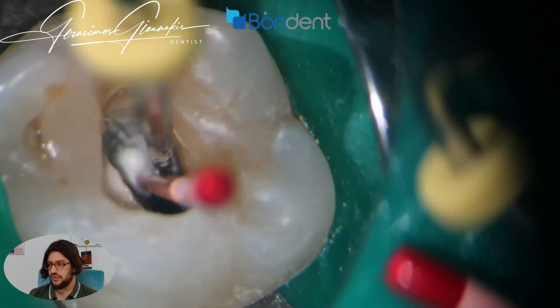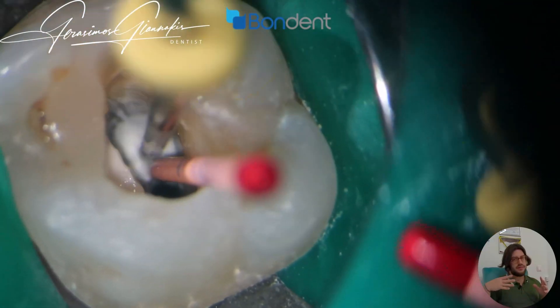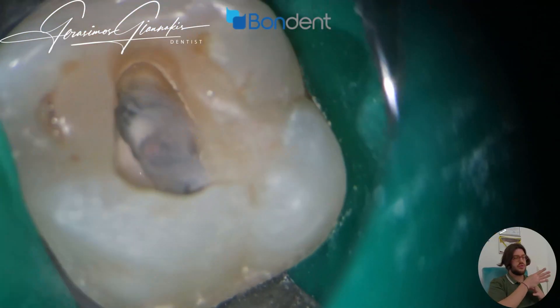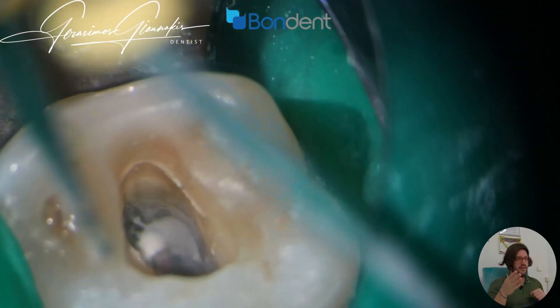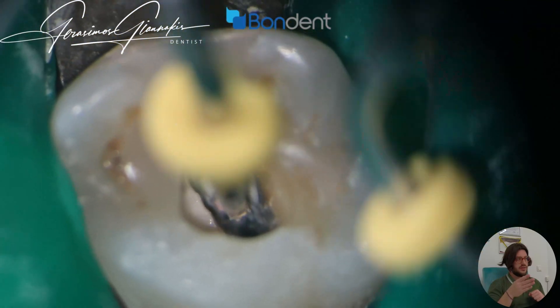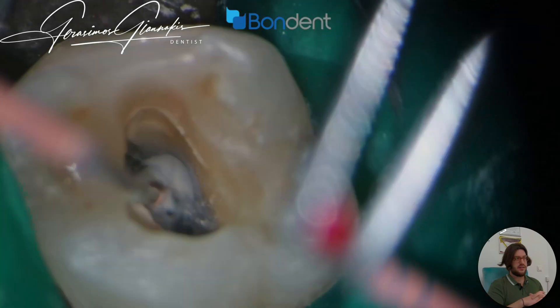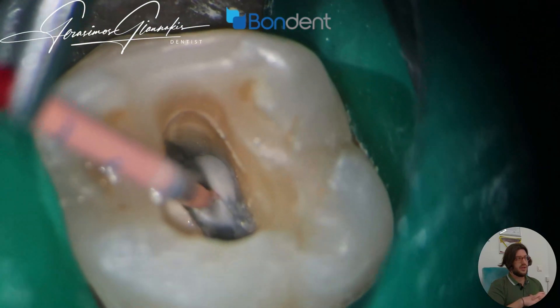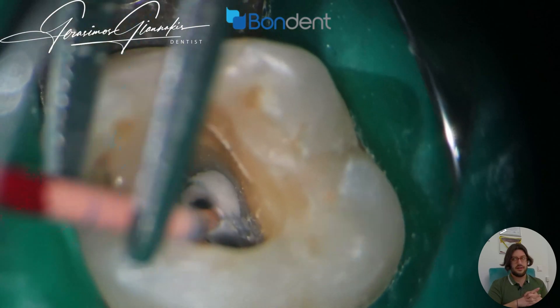Very important tip for the obturation of such canal configurations: always place the first gutta-percha with sealer in the most difficult to access canal, then cut it with the heat carrier in the orifice — just to avoid pushing gutta-percha and material inside the other canal. In this way we can easily put the other gutta-percha in the canal as well.